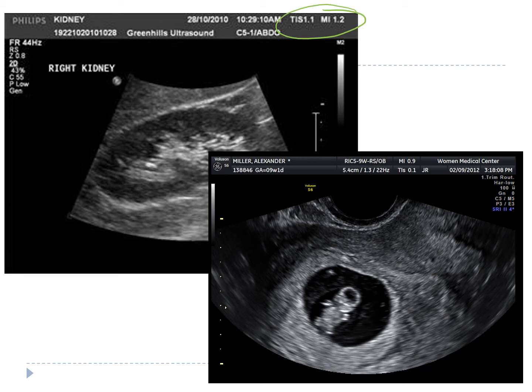We're going to compare those to a first trimester ultrasound where MI and TI are here, because we want to protect the fetus and make sure that it is not being subjected to too much power coming from the ultrasound machine. You can see the MI and the TI are much lower than what they were for the kidney. Go through different settings and see what the MI and TI change. These are also responsible for finding out how these change for your physics paper.